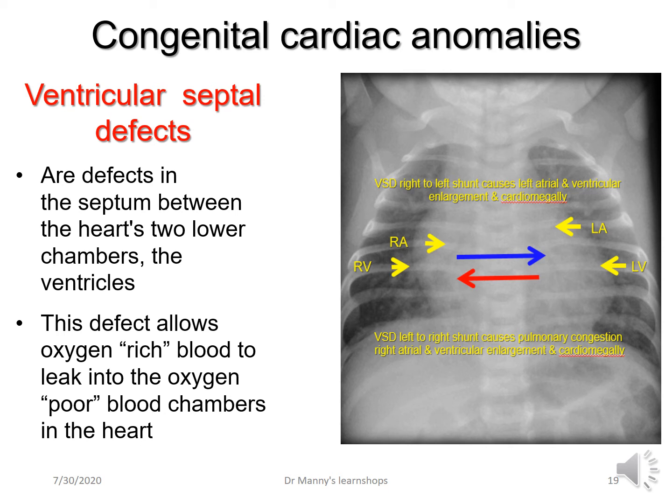However, on chest X-ray, how you recognise that will be by heart enlargement. The things that concern you are the patient's physical condition. And typically here, they would be short of breath, they may or may not be cyanosed, there would be failure to thrive because they can't take nutrition. They can't feed because they're too busy trying to breathe. Tachypnea.